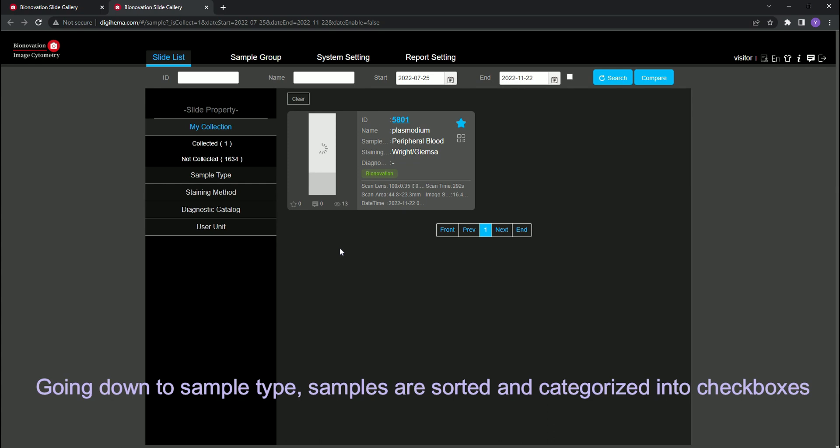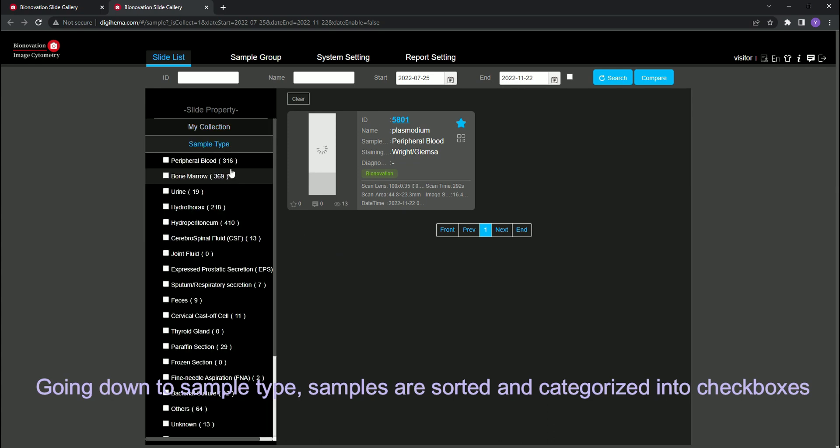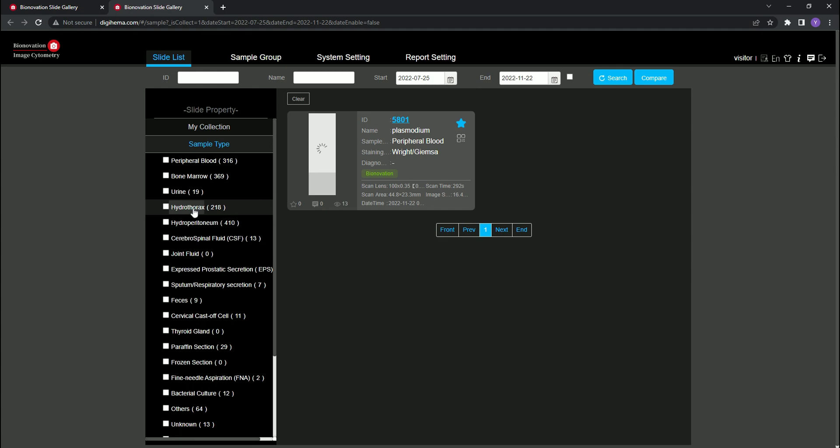Going down to sample type, samples are sorted and categorized into checkboxes.